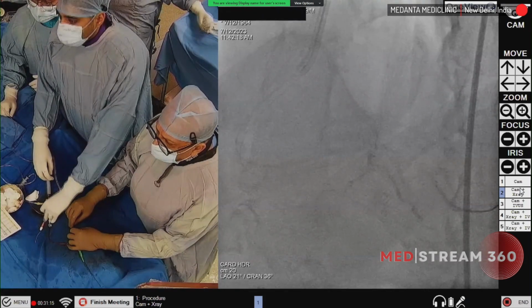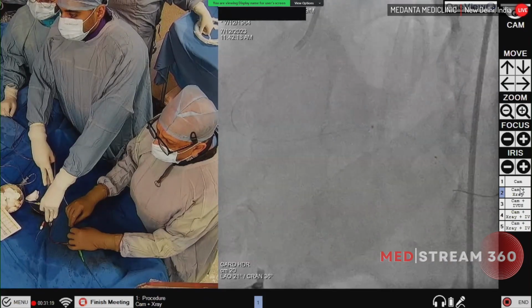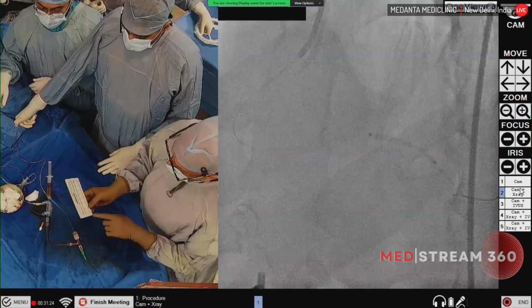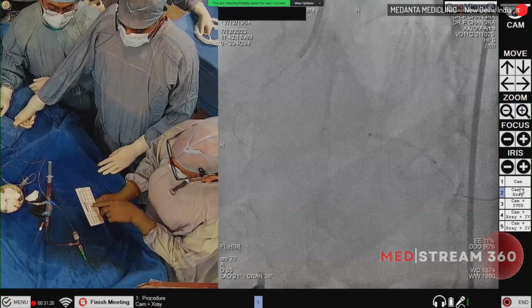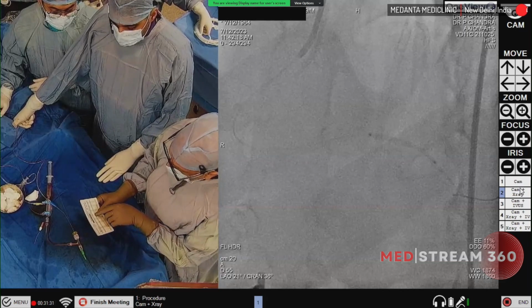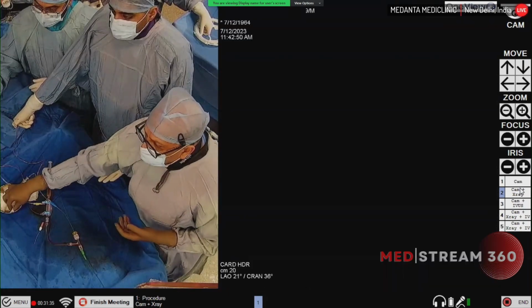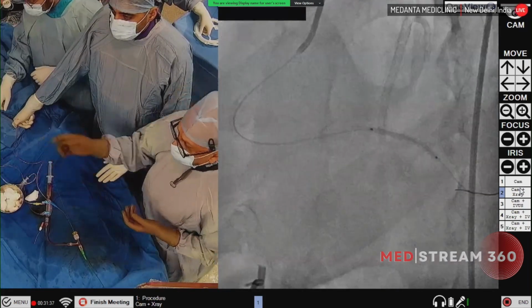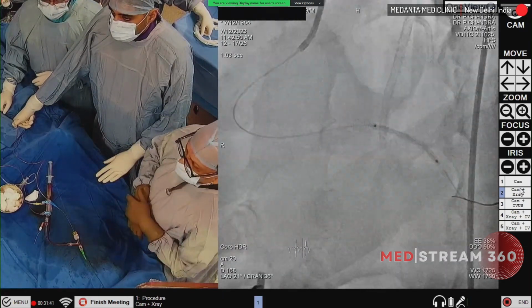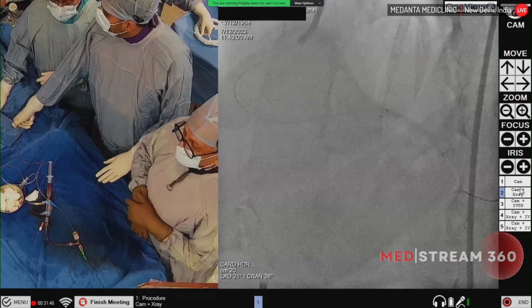Okay, check, please. Yeah, fine. Go up. 1, 2, 3, 4, 5. So the nominal is 6, and with the 2.25, at 5 atmospheres it is 2.23, and the size looks quite good. The vessel ID was about 2.2 to 2.25, so we are fine. I don't think we need to go any further in terms of pressure.